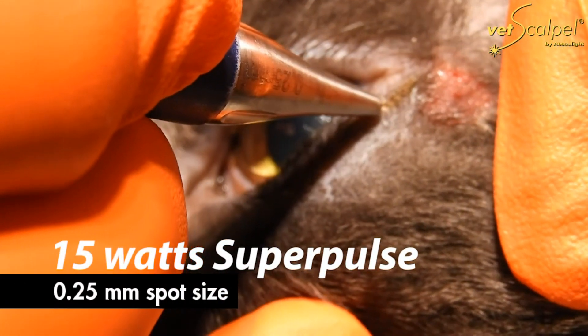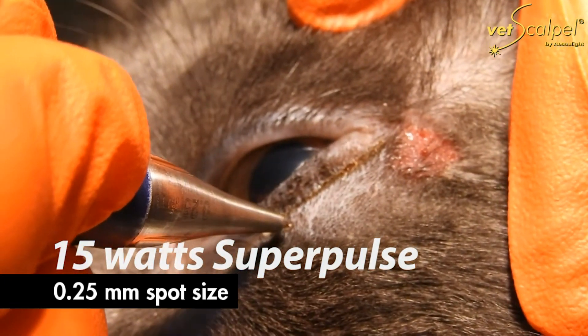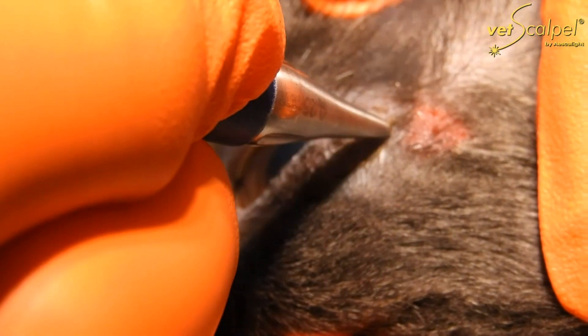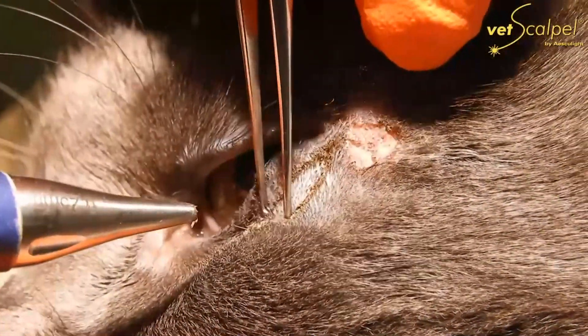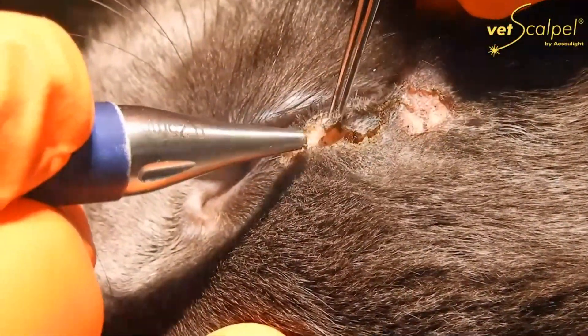We set the laser at 15 watt super pulse with a fixed 0.25 millimeter spot. Initially, I move the lid around a little bit to determine how much I need to take out. The little abrasion that he had, I thought would heal quicker if we just lasered the surface of it off with the laser.